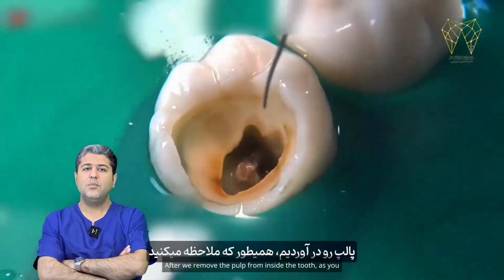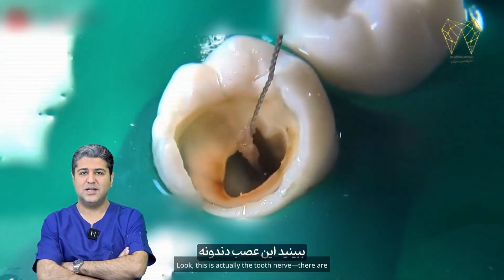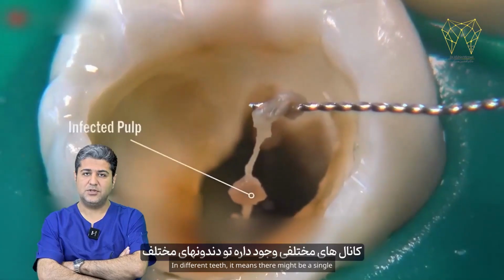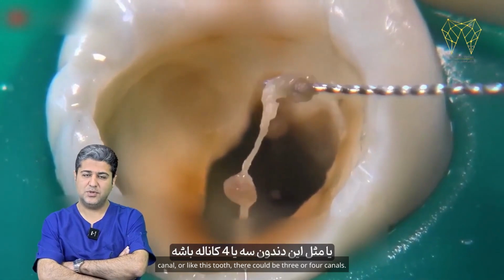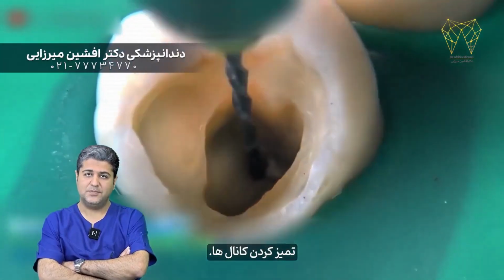After we remove the pulp from inside the tooth, as you can see here, in the same way, we also remove the nerve of the tooth. Look, this is actually the tooth nerve. There are different canals inside the tooth, each with its own nerve pathway. In different teeth, there might be a single canal, or like this tooth, there could be 3 or 4 canals. After the nerve is removed, we start cleaning the canals.